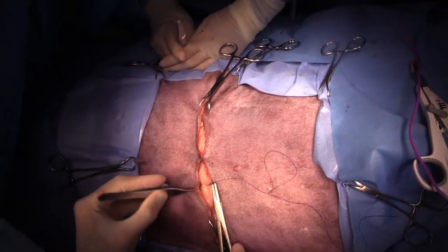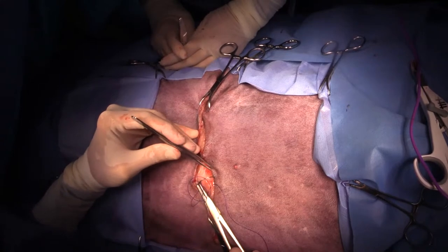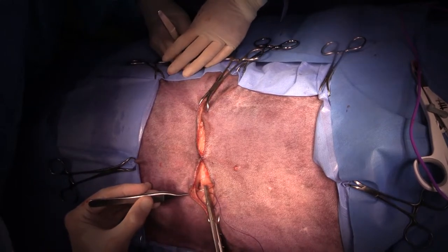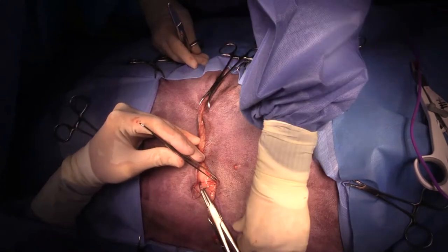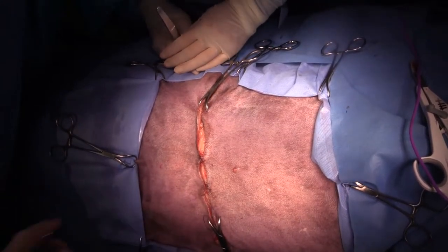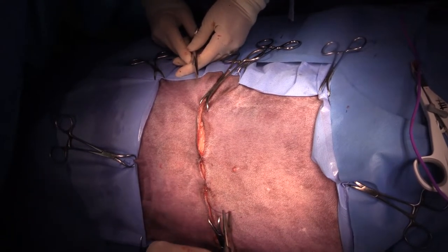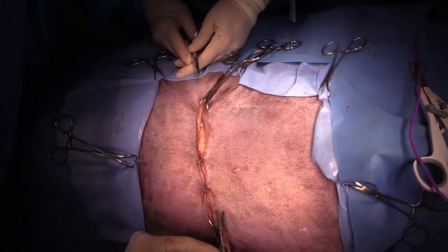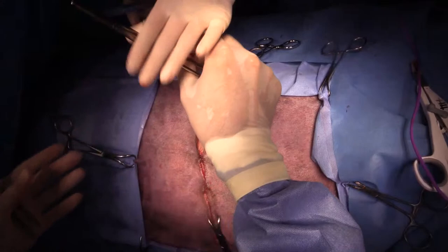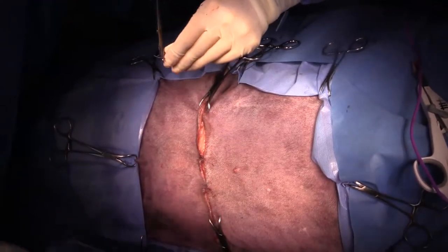The suture went through the skin a little bit. So while it doesn't matter, it doesn't look great. Going to keep going with that. So Sarah is going to keep doing that intradermal closure, and I'm going to do my Z-plasty.